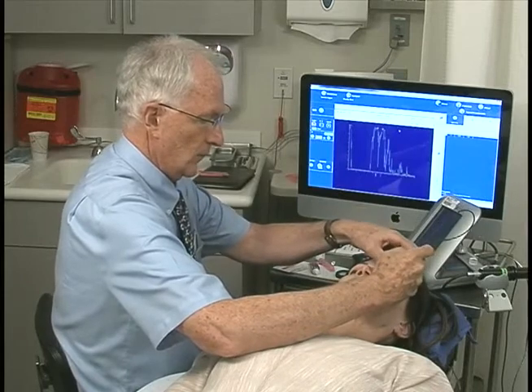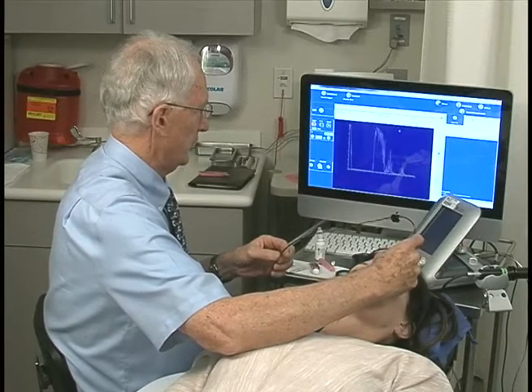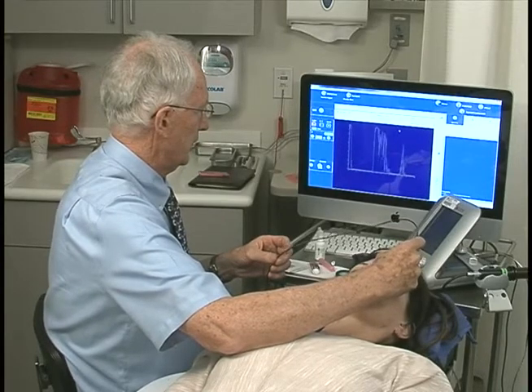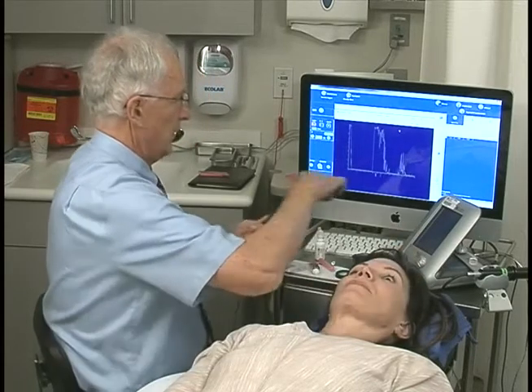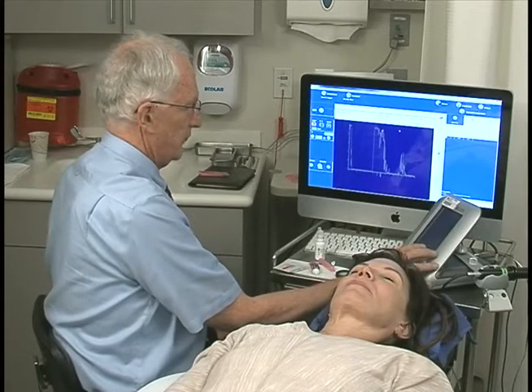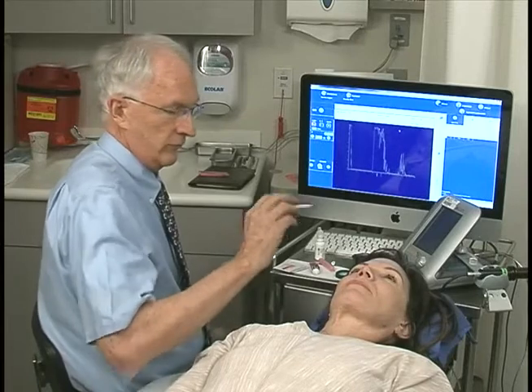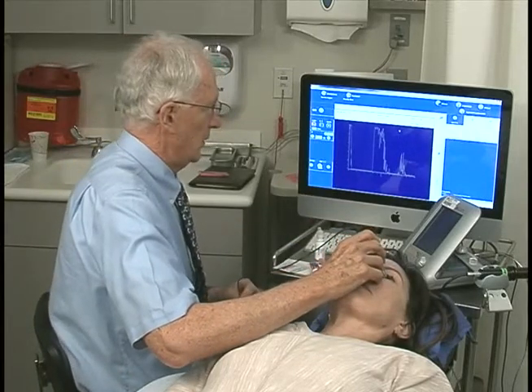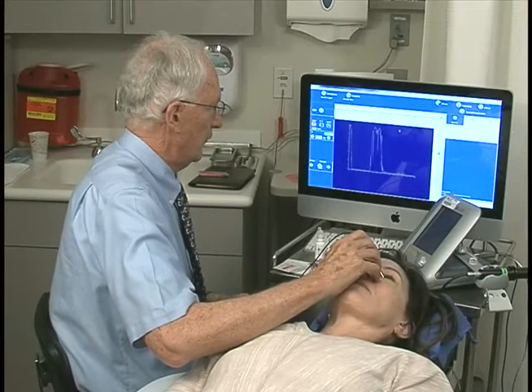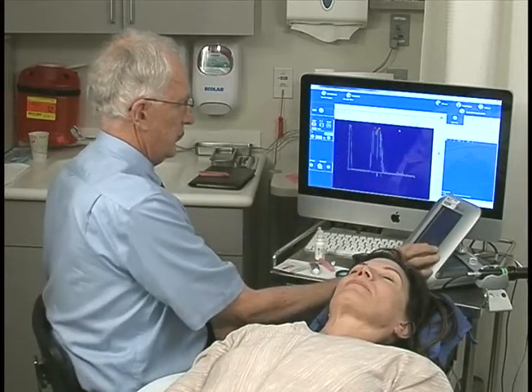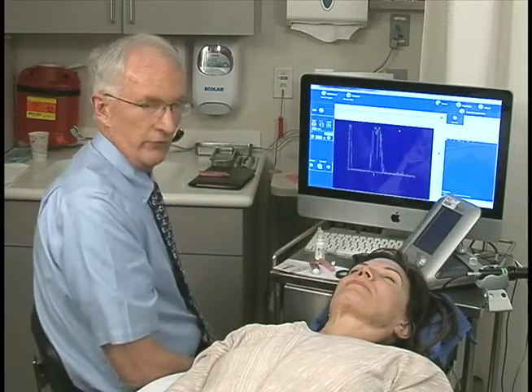I place the probe superiorly and aim towards the inferior orbit to get the inferior rectus muscle, which is usually the smallest of the extraocular muscles. I watch the pattern for a slight dip in reflectivity and use that for my measuring purposes. I put the cursor on one sheath of the muscle, the other cursor on the other sheath, and measure the inferior rectus muscle to be 3.64 millimeters. I then measure the lateral rectus muscle by placing the probe nasally on the globe and aiming towards the lateral rectus muscle across the globe. I watch the orbital pattern for a dip in reflectivity and measure the muscle thickness as 3.37 millimeters.